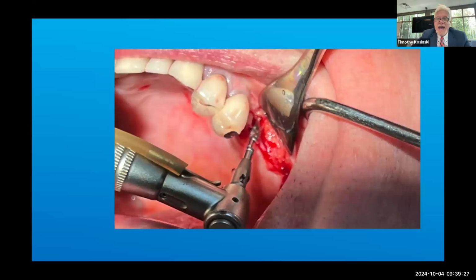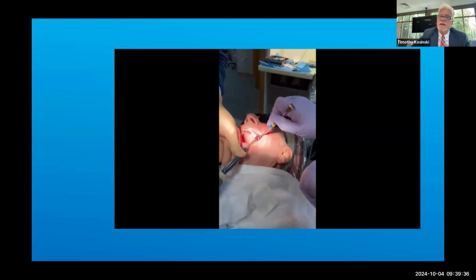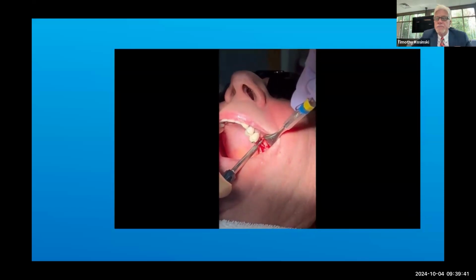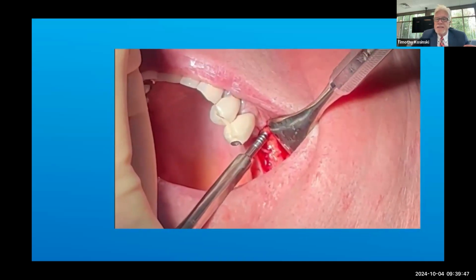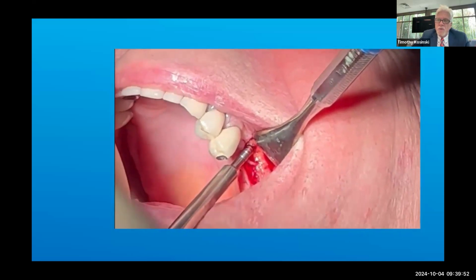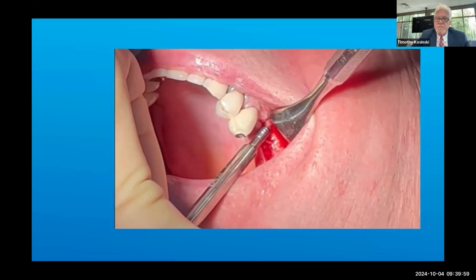I'm doing my osteotomy as we've demonstrated, short of the sinus floor. And then I'm going to use an osteotome. I know people are going to ask me about the different techniques, and there's a lot of them, but we can simply use the osteotome using the HT implant osteotome system, which mimics the implant itself. And what we're doing here is we're widening that medullary bone, which is relatively soft, and we're lifting that floor of the sinus. We're lifting that floor, lifting that Schneiderian membrane.